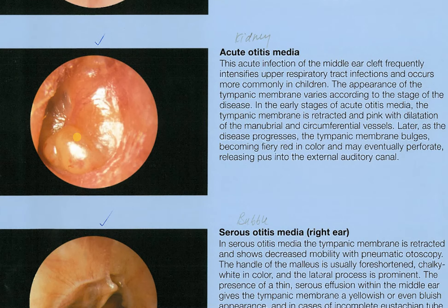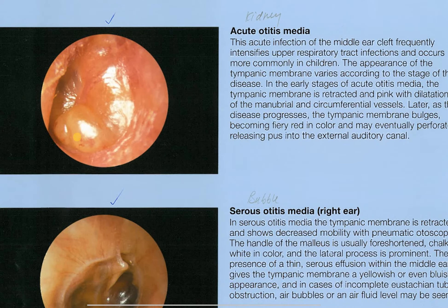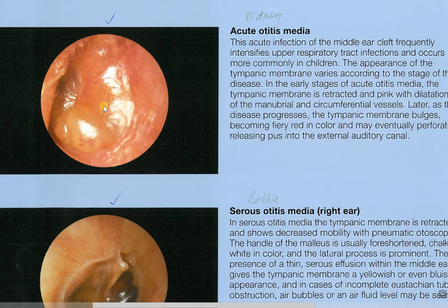Here's a common one: acute otitis media. This is what an infection can look like. There are different things that can cause the infection. Right here we're having a bulge of the tympanic membrane — you can see it bulging towards you. That's pressure trying to get out and the eardrum is bulging. I like to go in there and correct the pressure by opening up the tubes and the things we've talked about on prior slides.